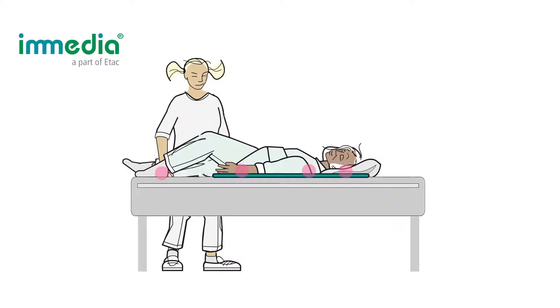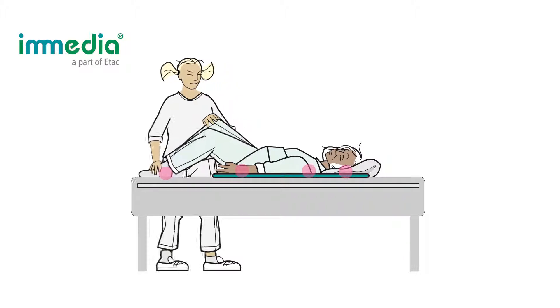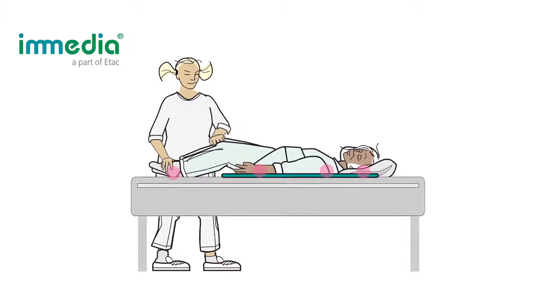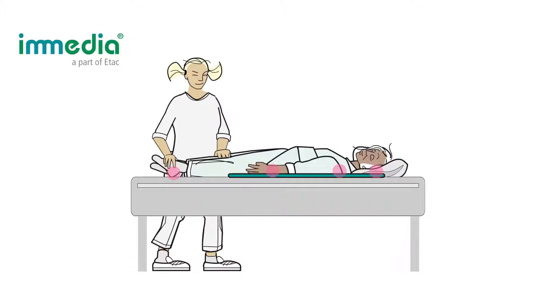Ask the user to bend her knees and assist the user if needed. Stand in a walking position and press slightly on the user's knees to facilitate the movement upwards in bed. With reduced friction between the bed and the user, the workload on the caregiver is also reduced.